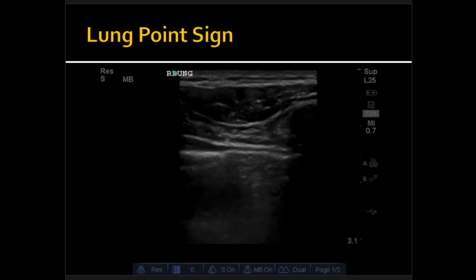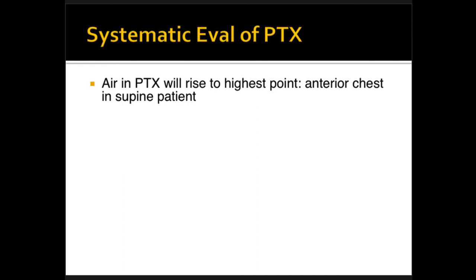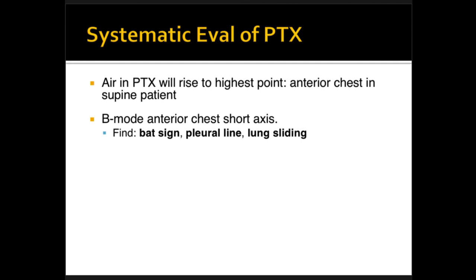Systematic evaluation of pneumothorax: the air will rise to its highest point, which is why you scan anteriorly. With the patient supine, the air rises to the top. Place the probe in short axis with the indicator toward the head. On 2D mode, find the BAT sign, look for the pleural line, assess A and B lines, and lung sliding. Those confirm normal findings. Then move down rib by rib, especially with high clinical suspicion for pneumothorax.